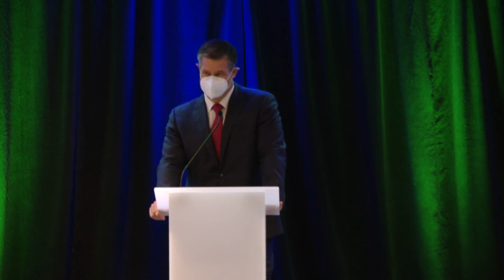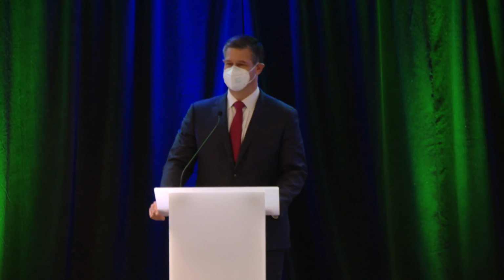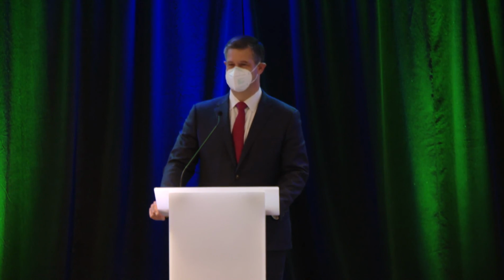Patients don't like catheters down, and in fact, an interesting observation we've had is that the UES sphincter is really nice to watch because it is powerful in squeezing really hard, oftentimes early on in the study because they don't like the catheter, then it settles down. The other thing is when we put this idea together with the old water perfused catheters that took a long time and the patients didn't like it, we said let's do 10 swallows or so, and measure from the first swallow on.